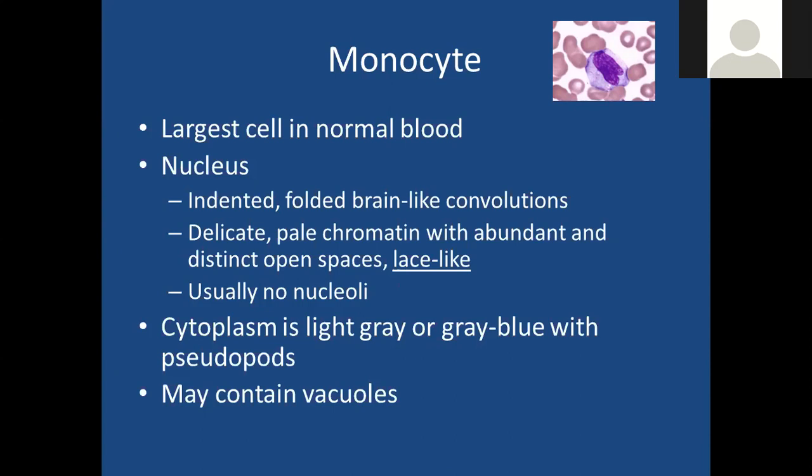One hugely characteristic feature of monocytes is that you may see vacuoles present in the monocytes. It's a known side effect of using EDTA as an anticoagulant. If you don't make the smear very soon after collection, the monocytes will vacuole. Also, because they're involved in phagocytosis, you'll have the formation of vacuoles, them getting ready to engulf trash or debris.